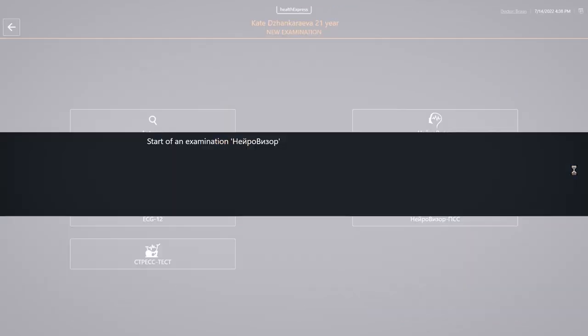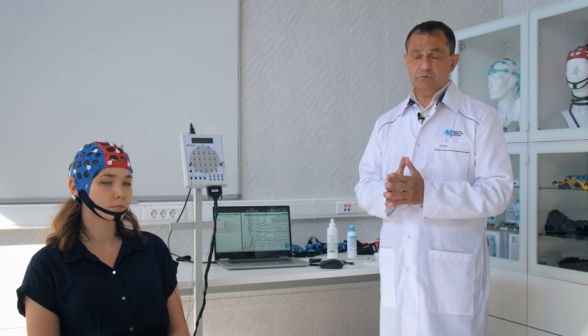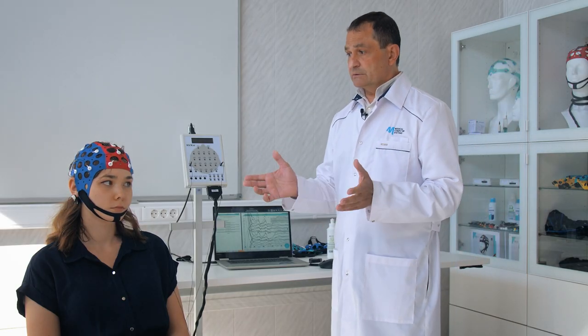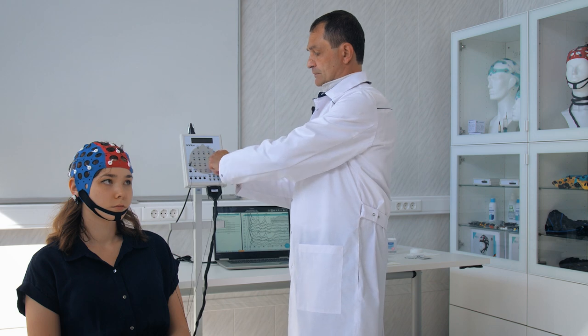After the recording is completed, the program automatically generates a preliminary version of the report, which the doctor has the ability to modify and rectify in a text editing tool. There is a need to fill out a multifunctional conclusion. The procedure for offline processing is commencing. At this time, we are removing the cap and disconnecting the ear electrodes from the subject's head in order to proceed with data analysis.